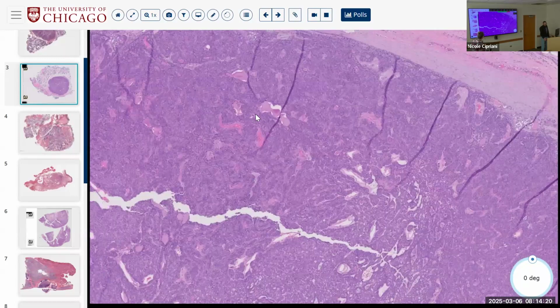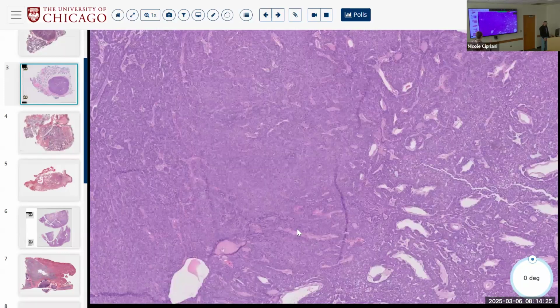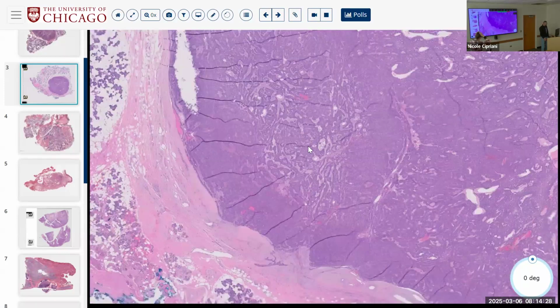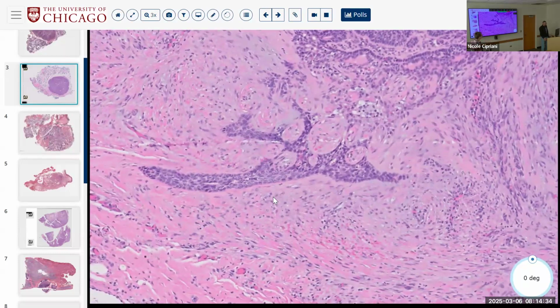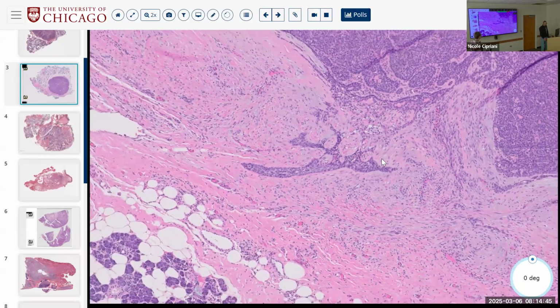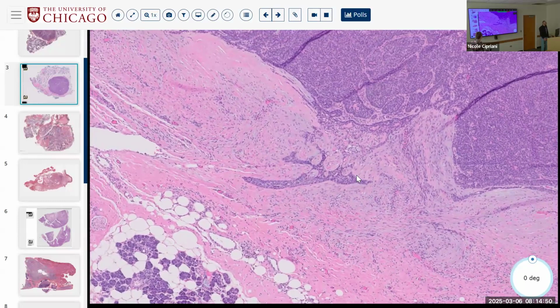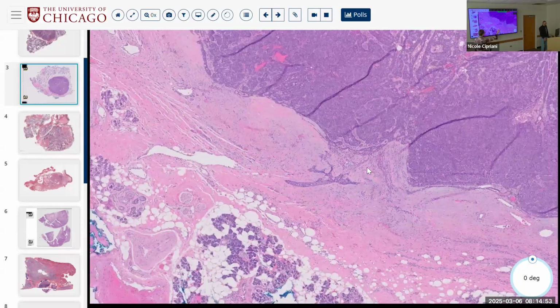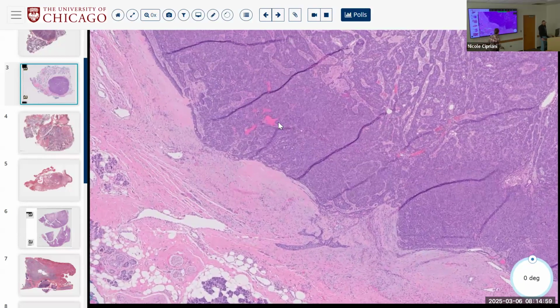And then just before we get to that, regarding that one area where you saw that little trickling out into the desmoplasia, aside from invasion, what could that represent? With fibrosis around it and tugging, sialadenitis, or... It seems like it's probably related to the tumor, so I would argue that it's probably not a metaplastic change, it's maybe a tumor-related change. Biopsy site, right? So with this desmoplastic fibrosis and tumor tugging into it in a solitary site, that could just be where they did the biopsy.